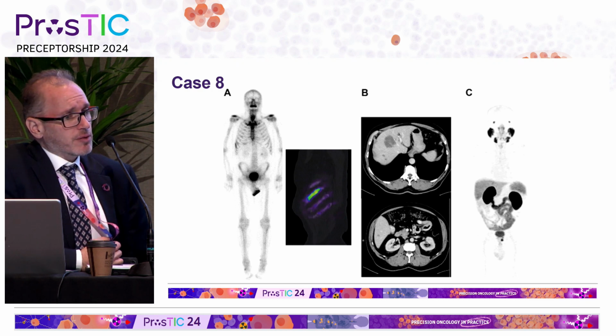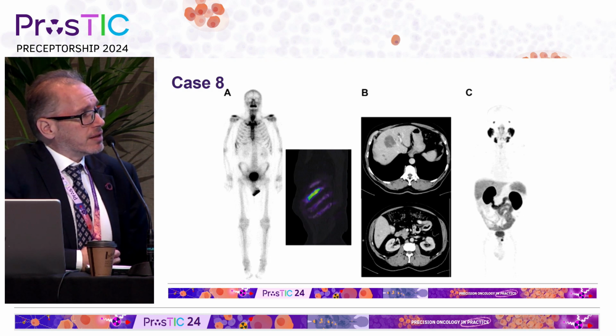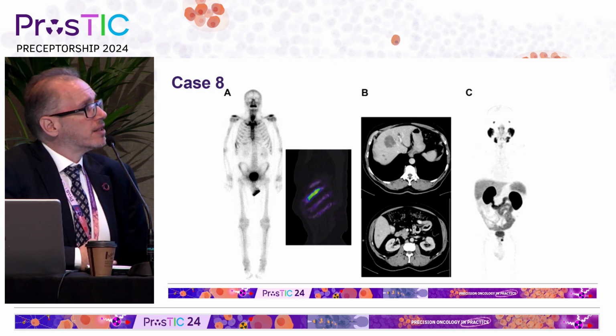And in fact, I think a liver biopsy was performed, and this was a colorectal carcinoma metastasis. The patient had a very good outcome with colorectal cancer treatment, and also had a radical prostatectomy to treat the Gleason score 9 prostate cancer. So again, denying patients curative intent prostatectomies based on false positive results, from both CT and bone scans, is something that's underestimated.